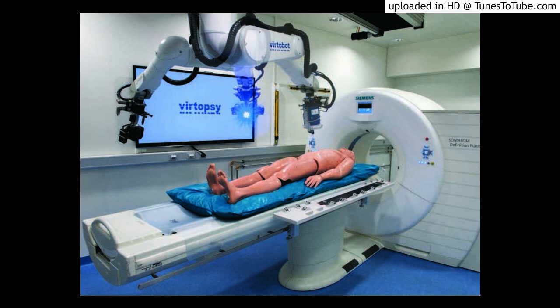3D photogrammetry-based optical surface scanning. It uses a surface scanning unit, which projects a fringe pattern over a surface and is in turn recorded by two cameras. A 3D image can be calculated using special software. True color 3D surface reconstructions are then obtained by adding digital photography of the surface from different angles, which are added to the data. It is an accurate documentation that can document structures less than 1 mm in size.